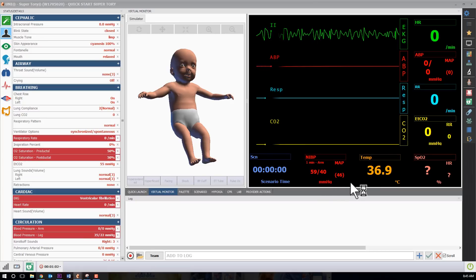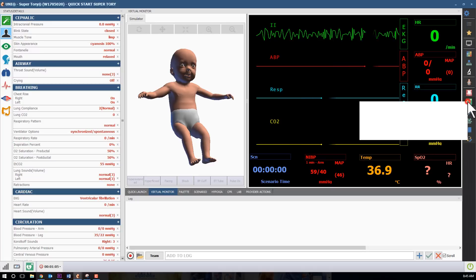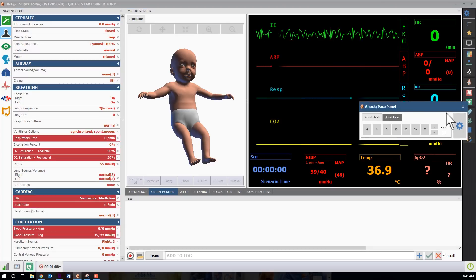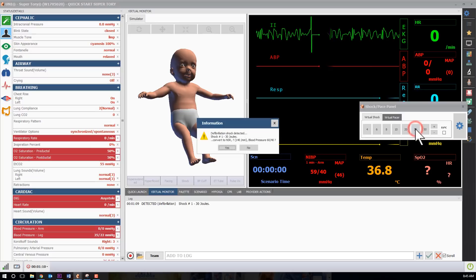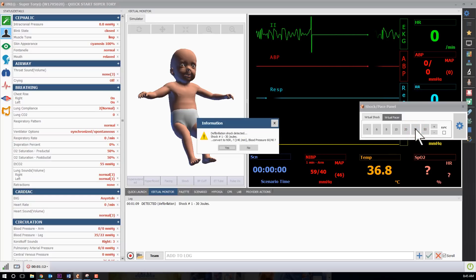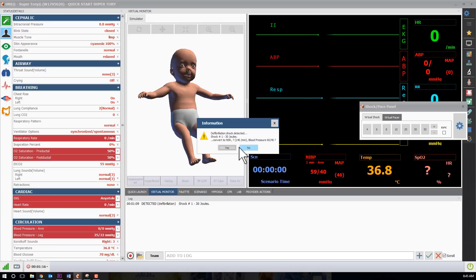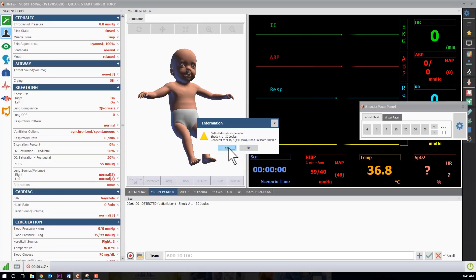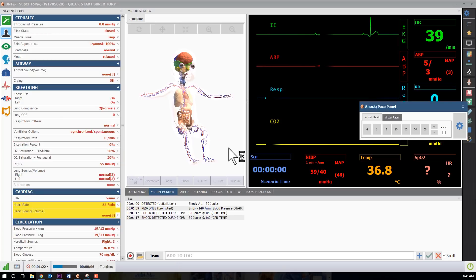To defibrillate with the virtual panel, click the Shock Pacer icon in the menu on the right. Click the desired strength of defibrillation to administer a virtual shock. Once the electrical therapy is detected, Uni will ask whether to convert to the designated vitals. After you click Yes, SuperTori will slowly trend to the programmed vitals.